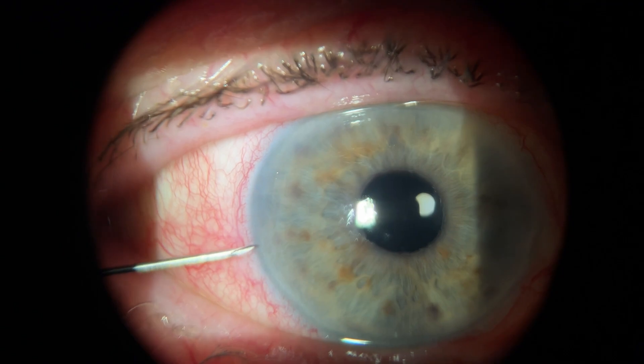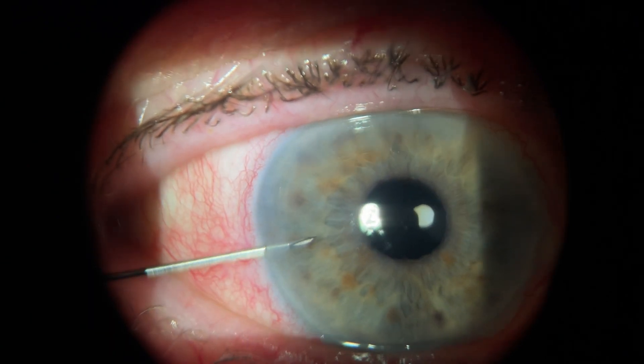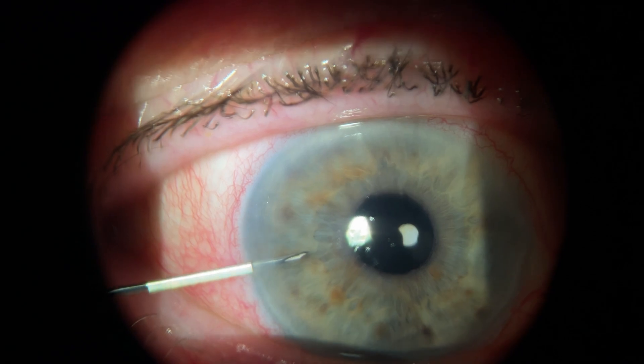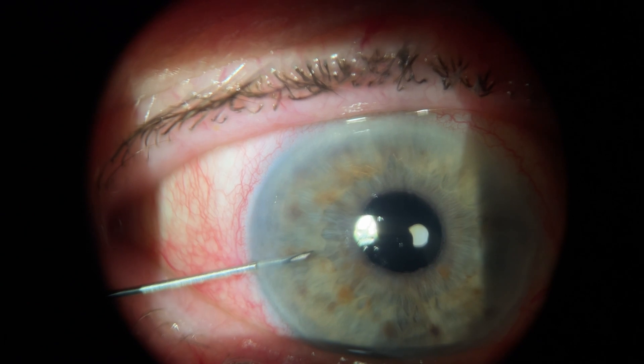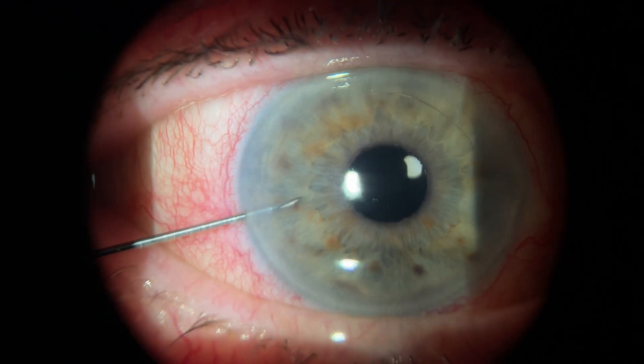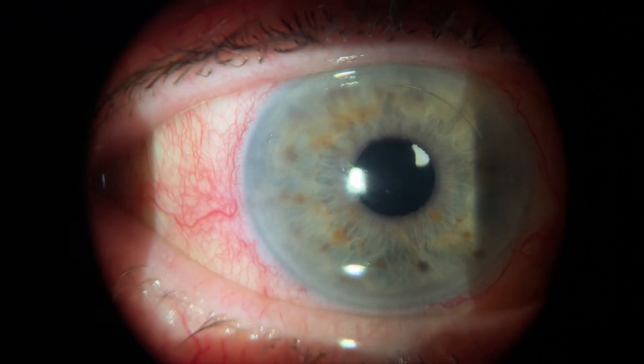Now let's see what this procedure looks like at the slit lamp. I use the needle to puncture the cornea parallel to the iris. You can see a little resistance, but it's not much. Then I just stay in there for a couple of seconds. By pushing down on the eye gently with your needle, you can estimate the pressure. Here at the beginning you can see there's quite a lot of resistance when I'm pushing, and after a few seconds you can see the eye gets a lot softer. Once you're happy with your pressure, you can remove the needle.